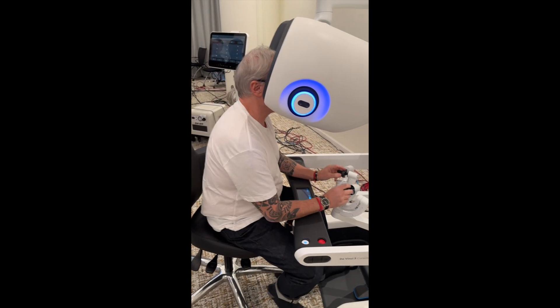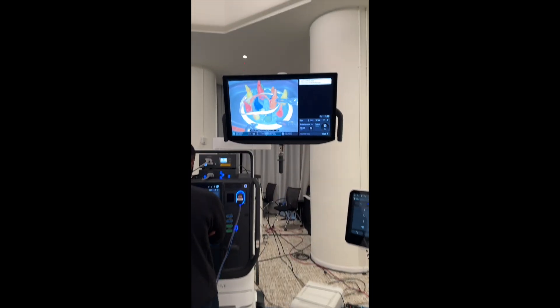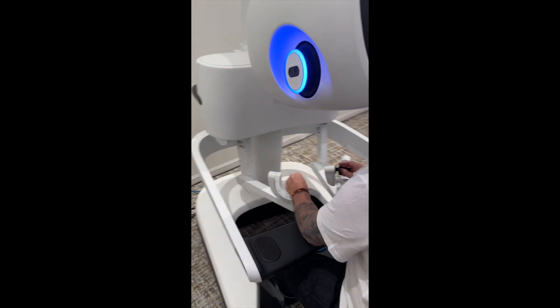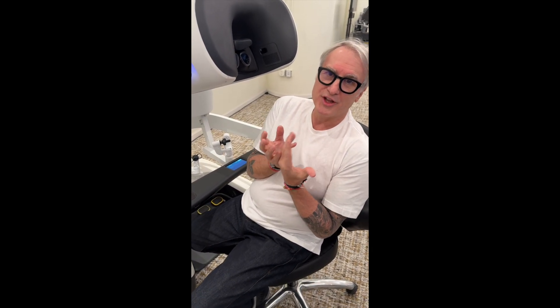The second thing I want to show you: with my hand, I'm pressing on this — and this is plastic — and I feel resistance. And this is soft foam, and I don't feel resistance. So this is what we describe as haptic feedback, which is quite incredible when you think about it — that the technology has gotten here.